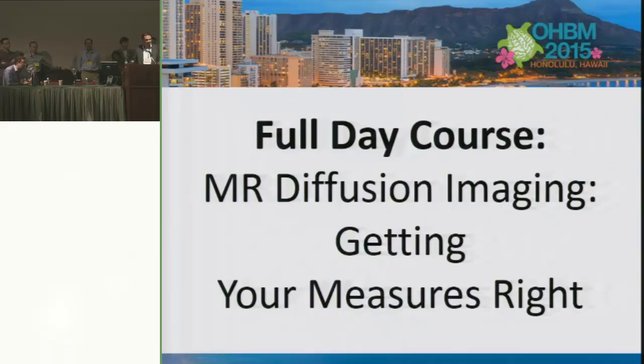Okay, thank you. If I can add something, you also need to take into account your whole data set, because if you have one or two bad subjects, it's probably easier to just discard them. But if you have 20 to 30% of your subjects with a lot of artifact, you might want to rethink and save as many as possible. So I think it also depends on the data every time.